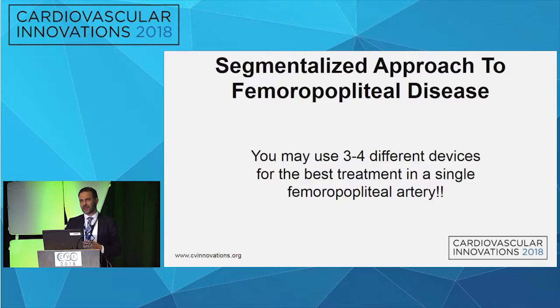So at the end, I think that in the future, at least in my practice already, I may enter a femoral popliteal lesion and end up coming out with 3-4 different devices that I've implanted in a femoral popliteal segment.